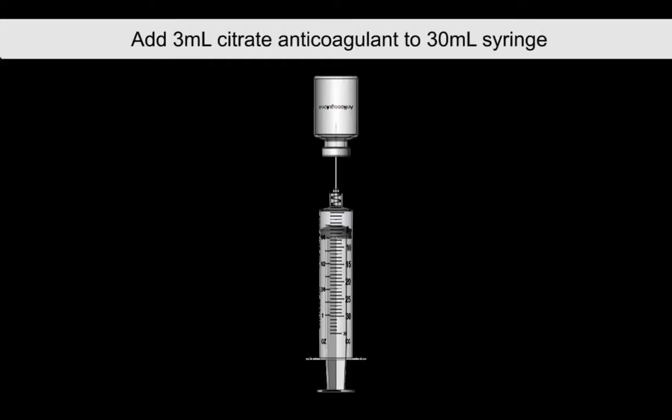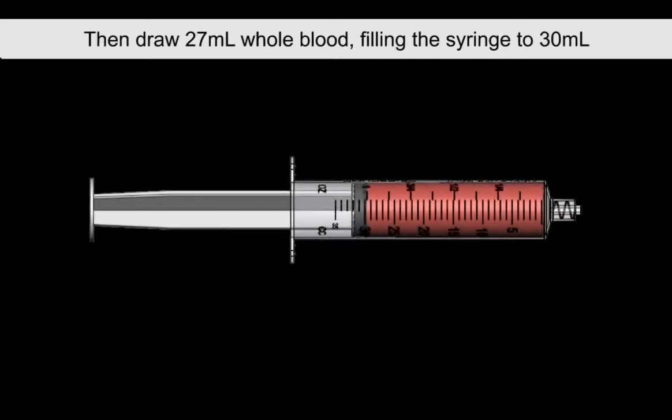To begin the procedure, add citrate anticoagulant to the 30ml syringe, then draw whole blood from the patient, filling the syringe to 30ml.